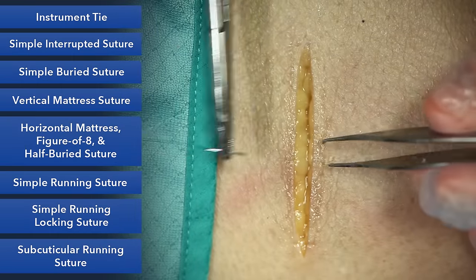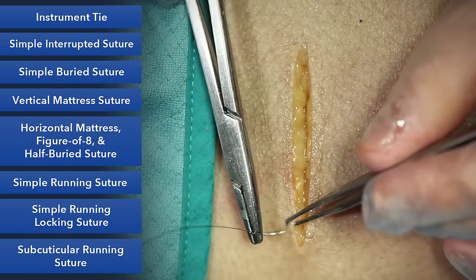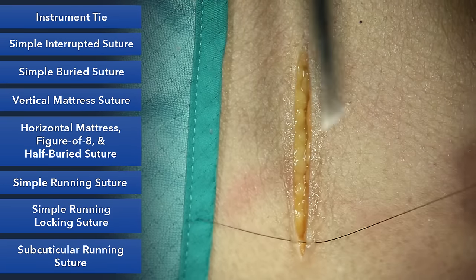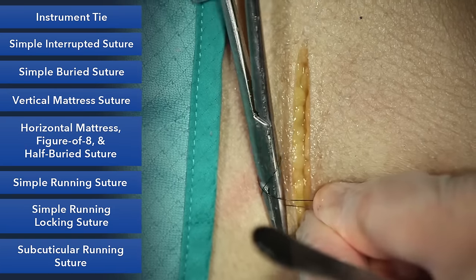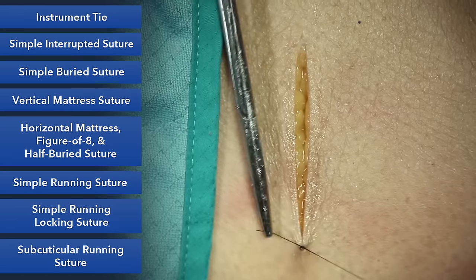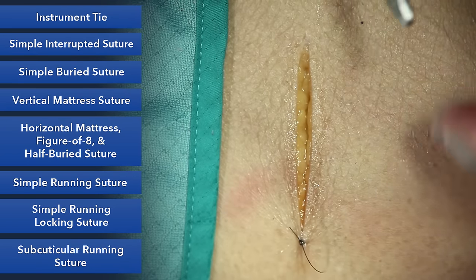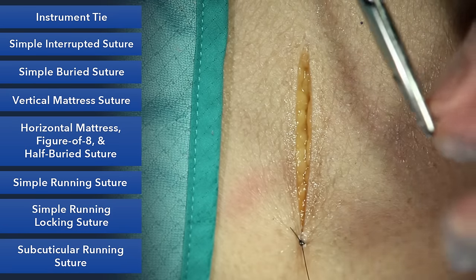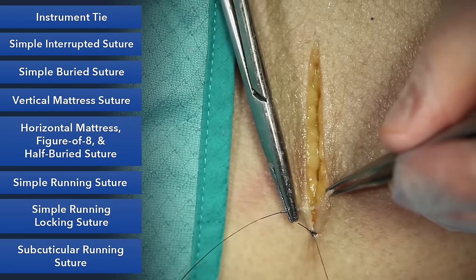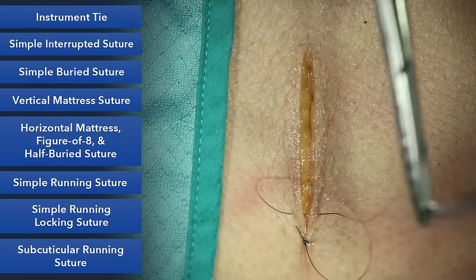A variation of the simple running suture is the simple running locking suture. We start off the same, with simple bites and a nice instrument tie. And this is a very helpful suture when you're sewing under some tension, and especially when you don't have an assistant who can help hold the suture for you and follow you. You'll take your simple bites again, 90 degrees, evert the skin edges, but before you pull up, you'll make sure and actually lock the suture.